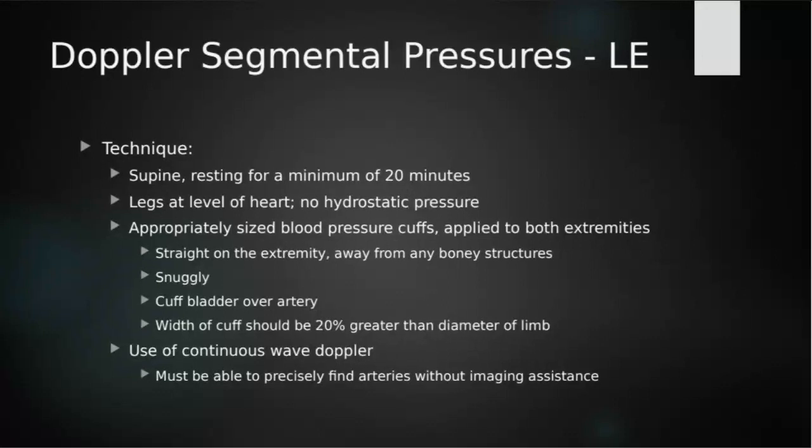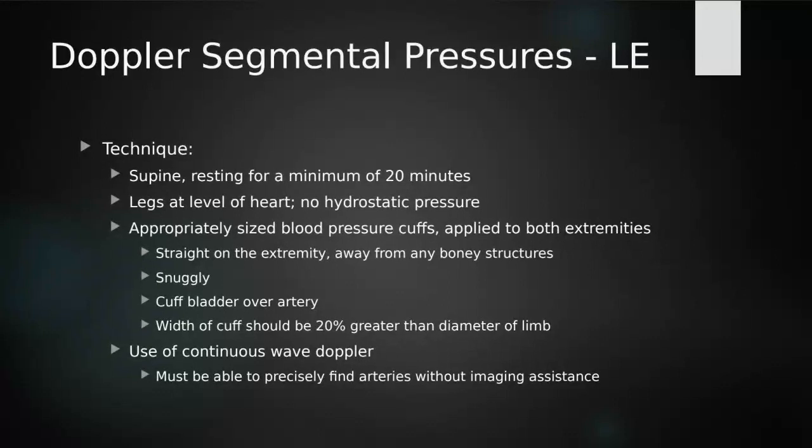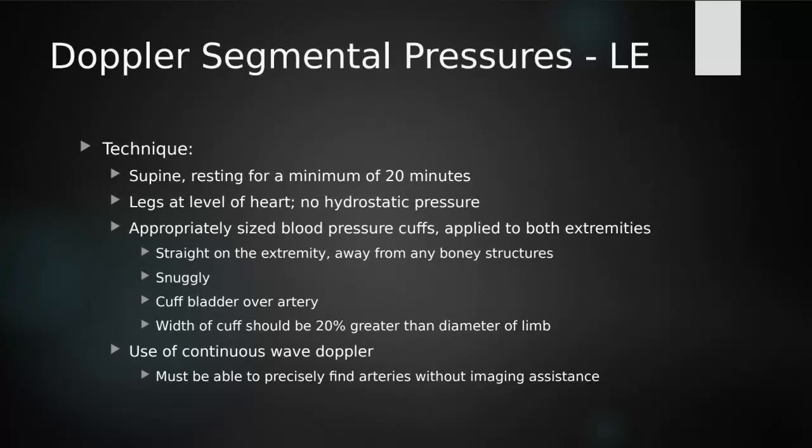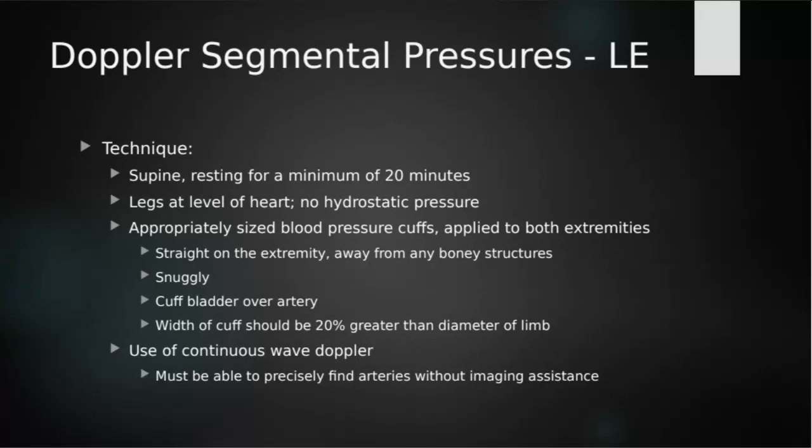We also do not want to place a blood pressure cuff over a bony structure. So we're not putting a cuff on top of the kneecap. We're not putting a cuff right at the ankle with all of our malleoli hanging off our ankle. We're keeping it away from bony structures. We're putting our cuff on snugly so that it doesn't shift. We're also making sure that we have the cuff bladder over the artery. So we want to make sure that the reading location is placed where the artery is, along the medial aspect of the patient's leg.